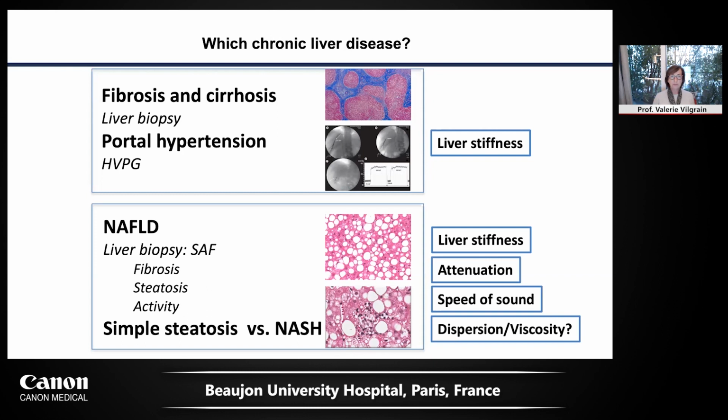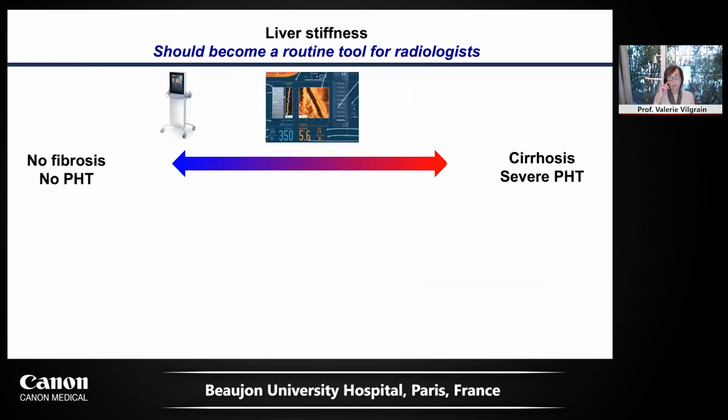Let me start first by, now I would say, a routine tool for radiologists, ultrasound people, that is liver stiffness.